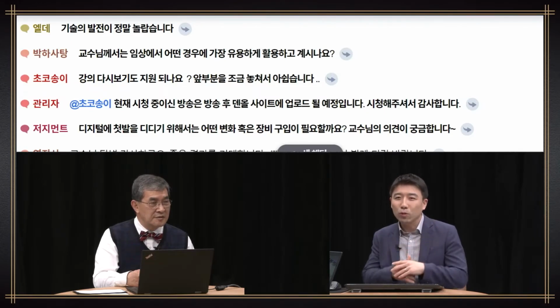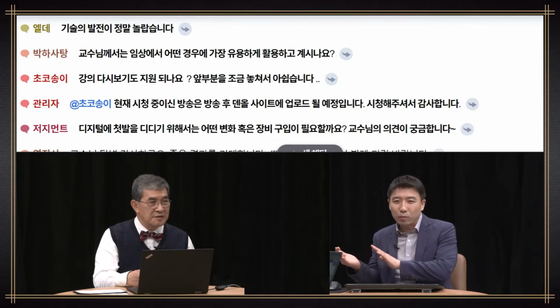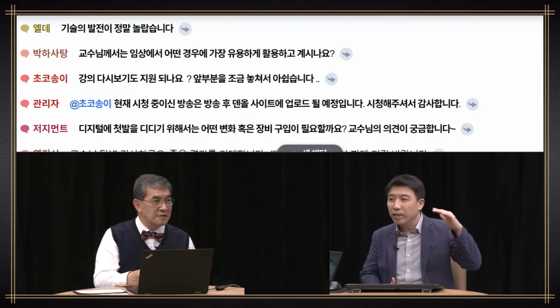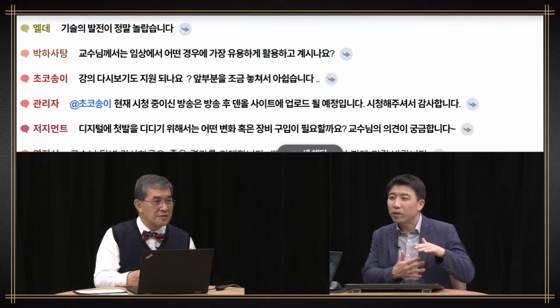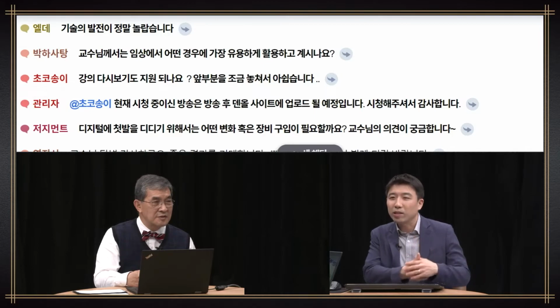For anterior prosthesis, you can do it using photos, but you can use different views from different angles. You can see ahead the patient's original dentition and the designed prosthesis, and in larger cases, you can use it for a virtual face bow. You can find the occlusal plane. Of course, you can do it using a face bow, but I use it as a virtual face bow.